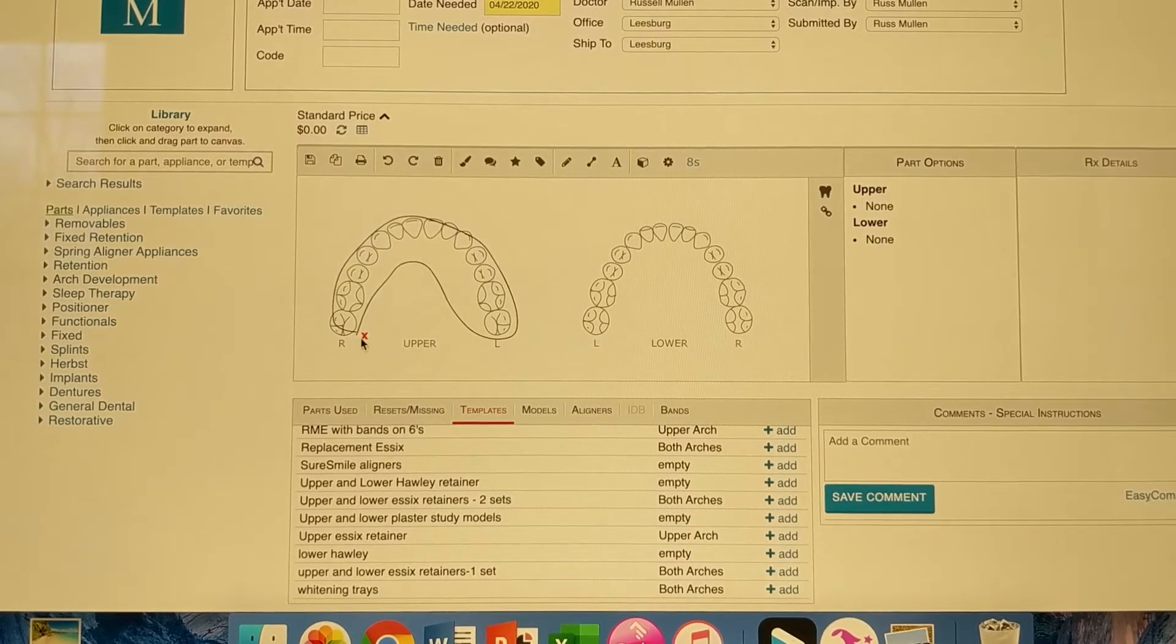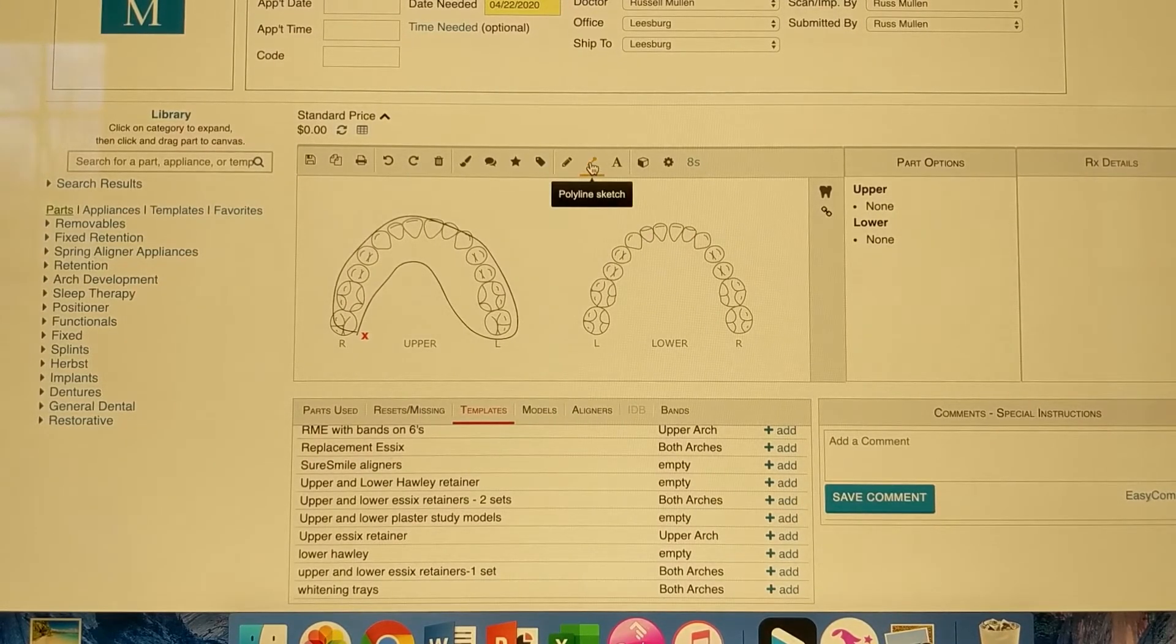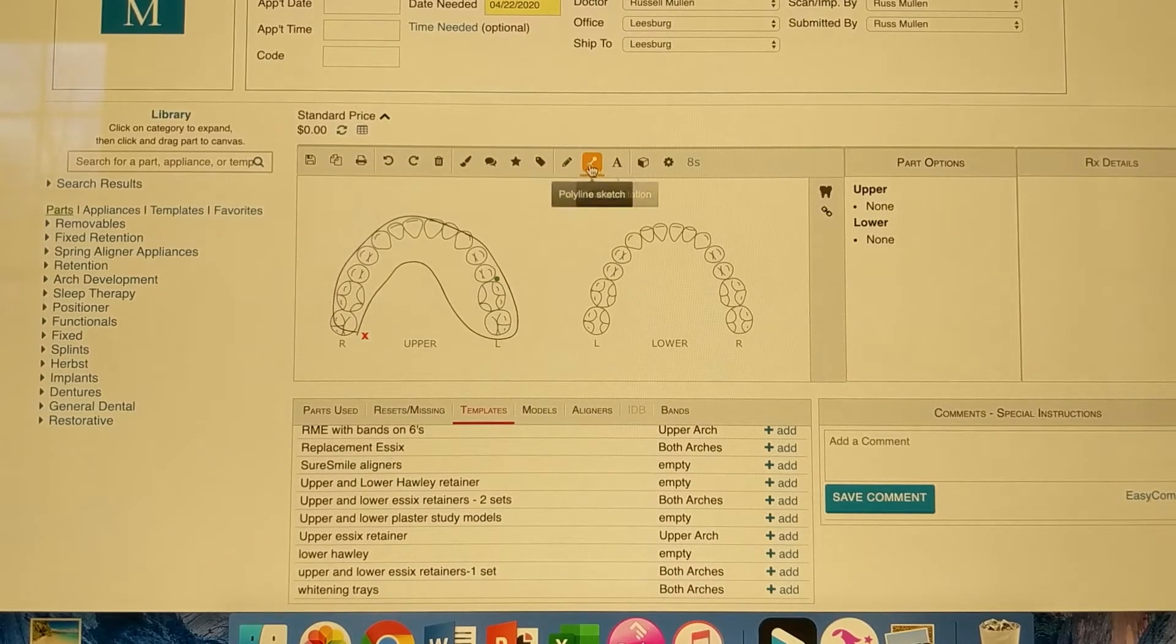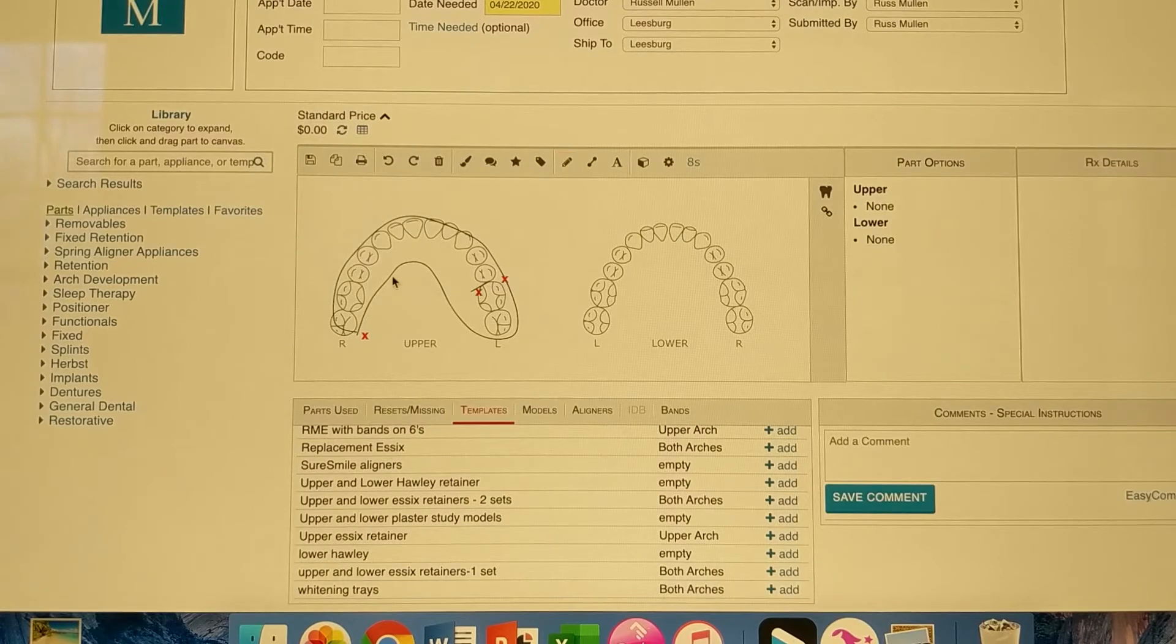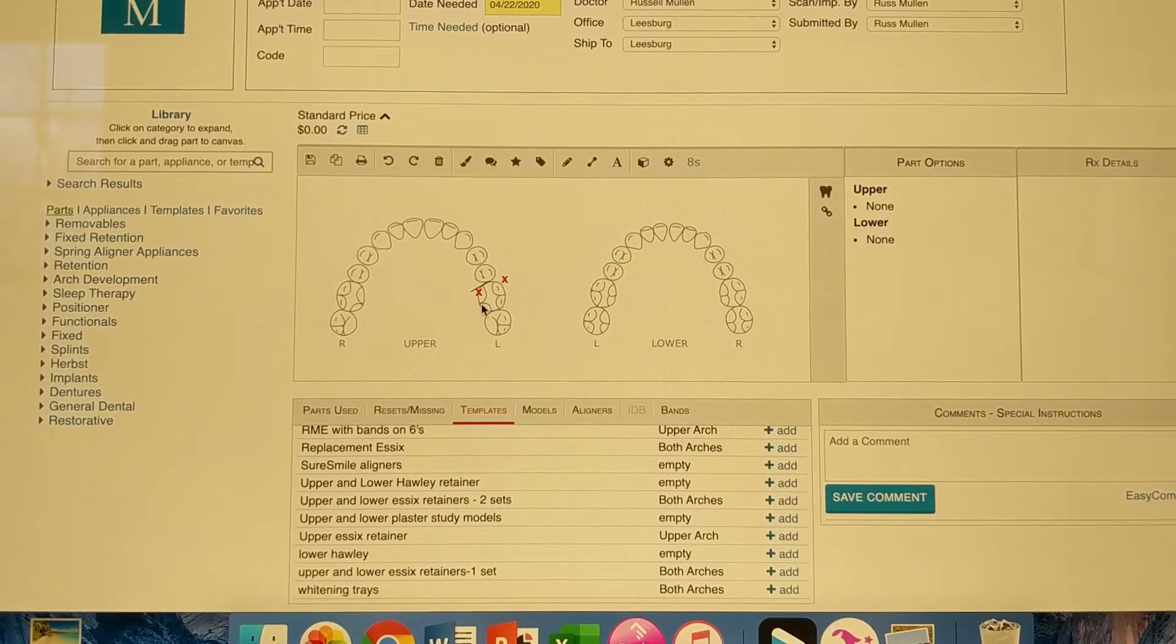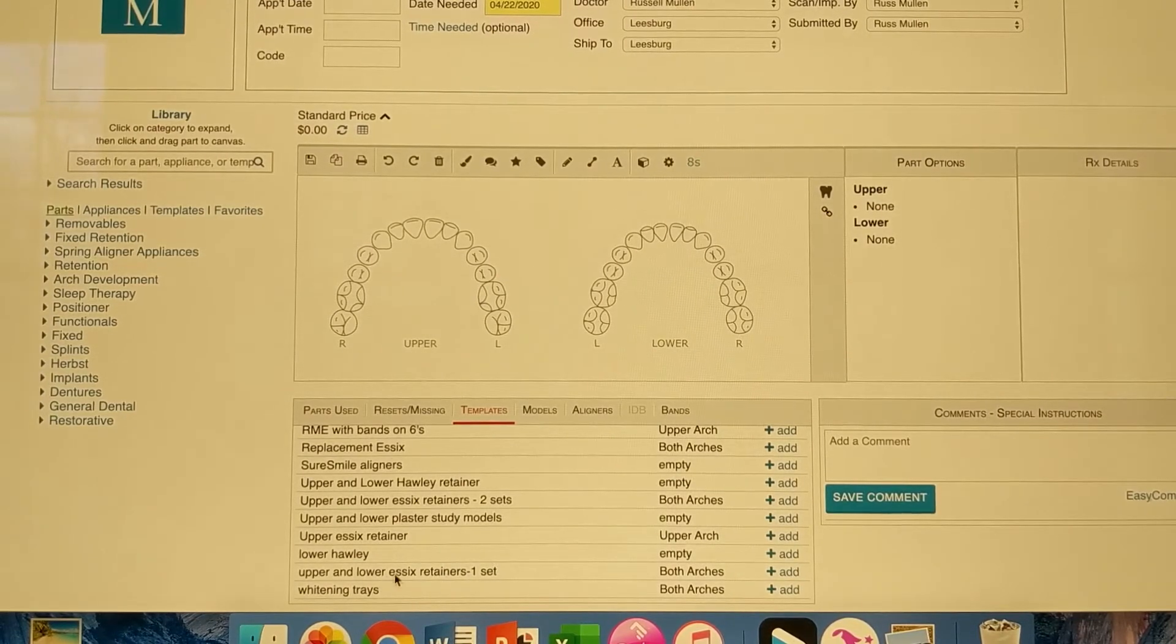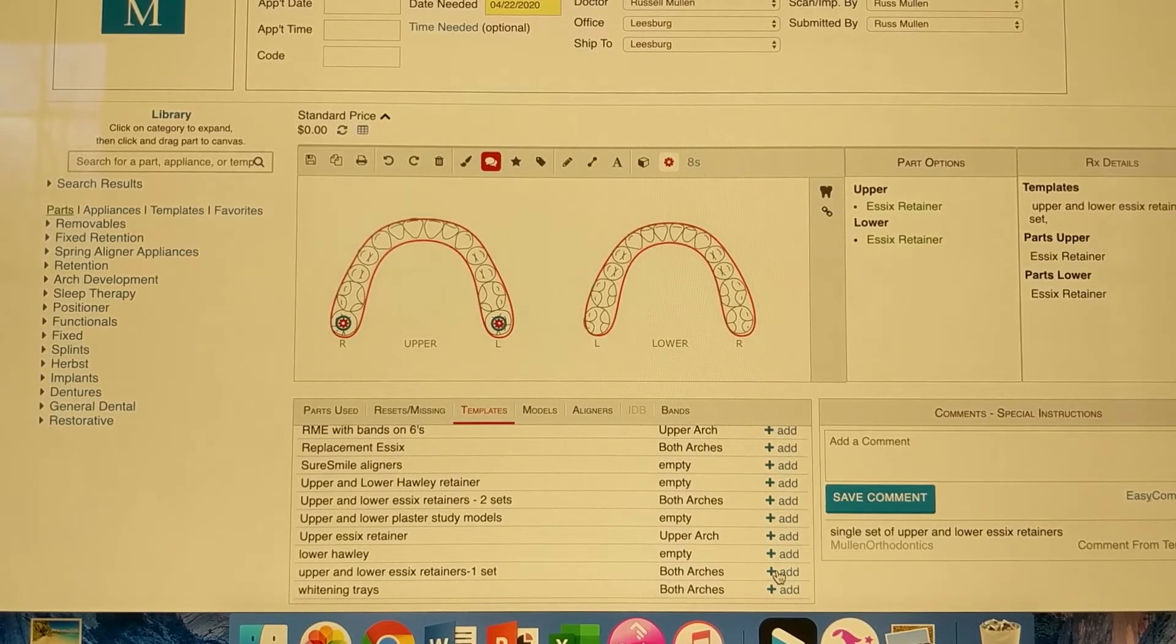Let's say we want that going to the lab. We'll add clasp. Add a clasp here. And actually delete them all because we're just going to do the template here. So let's do upper and lower Essex retainers, one set. So we'll add that.